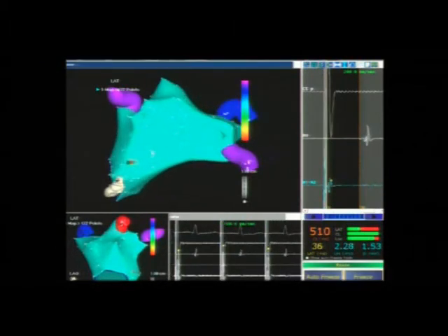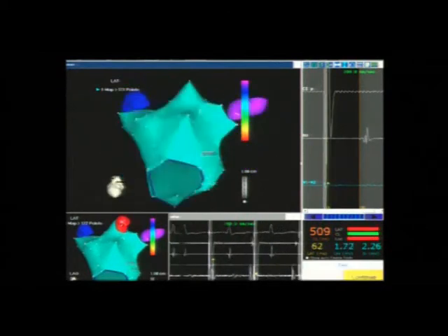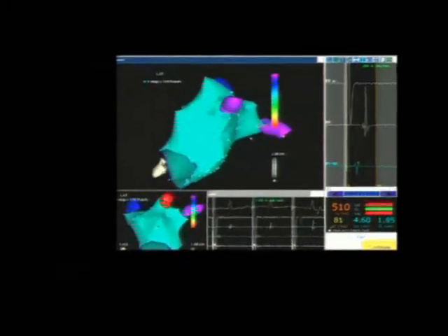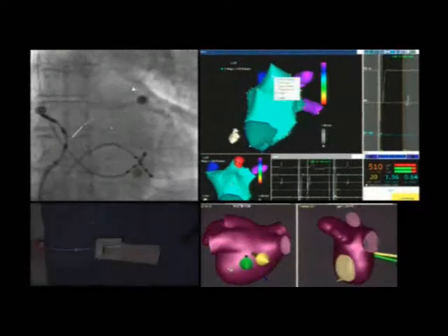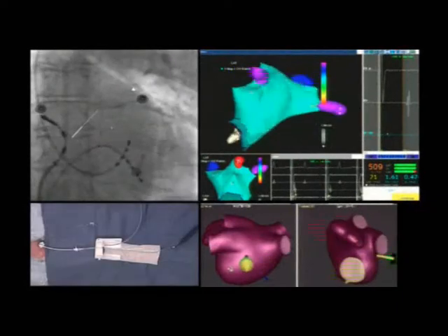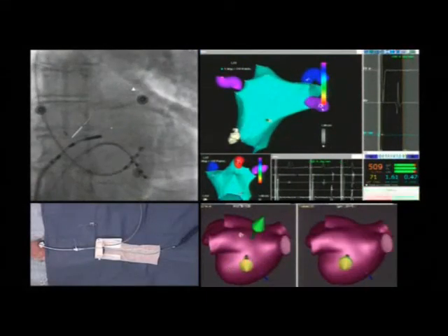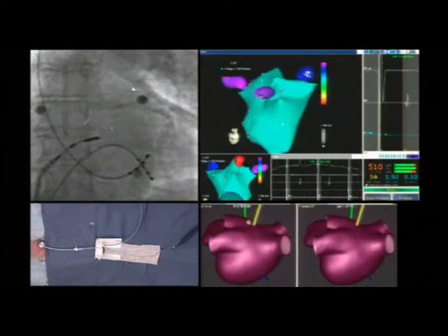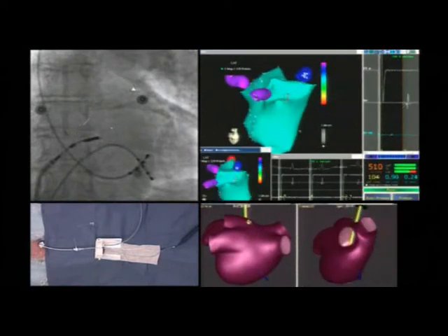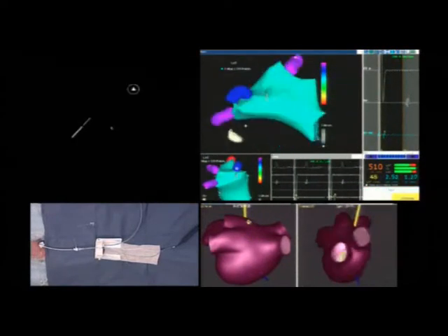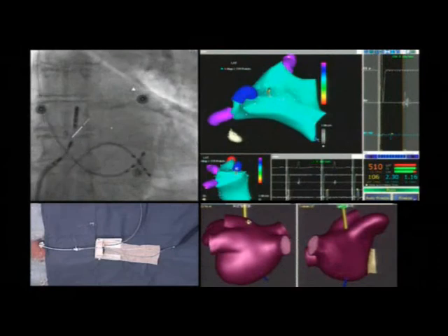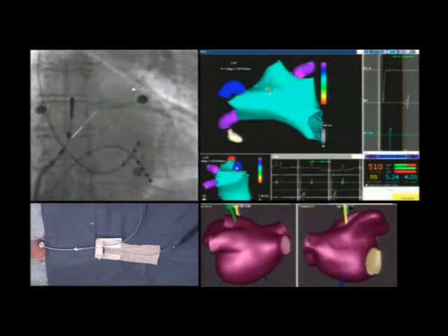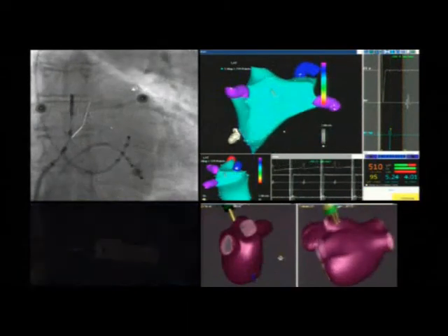In particular, the catheter adheres softly on the atrial wall and is dragged along the endocardial surface without being pushed against it, avoiding the volume overestimation that is the typical pitfall of the manual approach with standard catheters. As the mapping process is completed, the ablation phase may start.